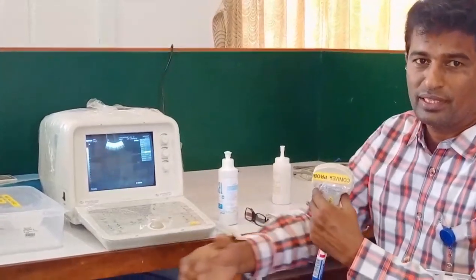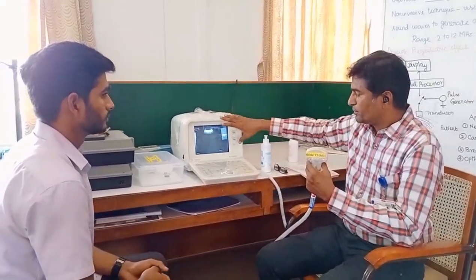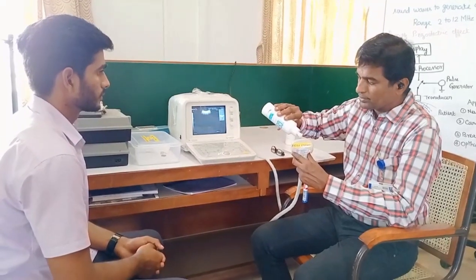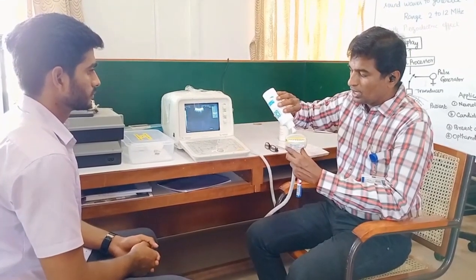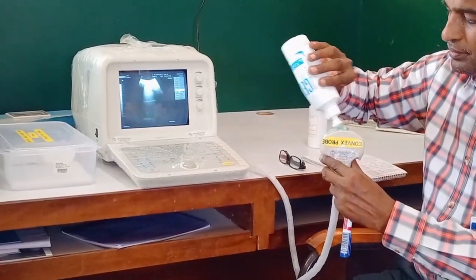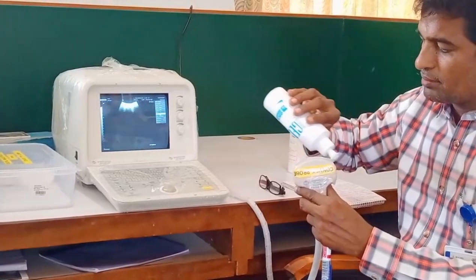Here we have volunteer Mr. Kabilan, one of my students, and this is the display unit and the keyboard. And normally any probe, when we are placing it on the patient, has to be applied with gel to have smooth conductivity. So I am applying this.